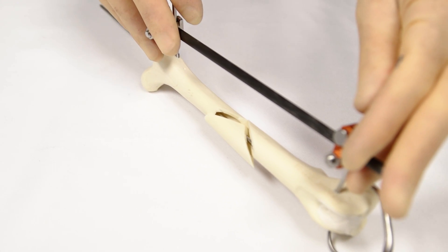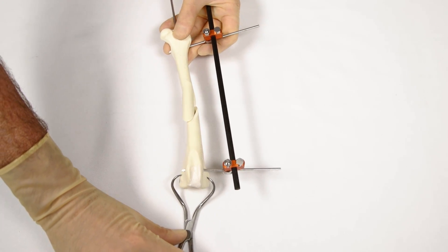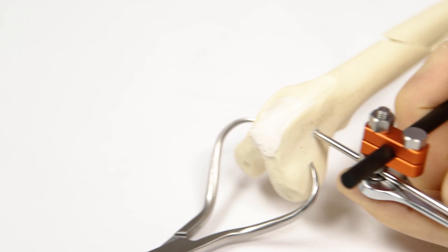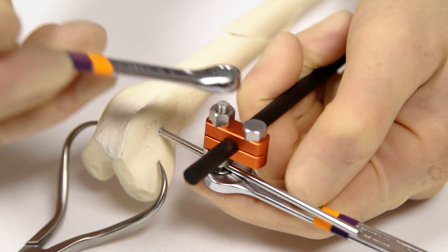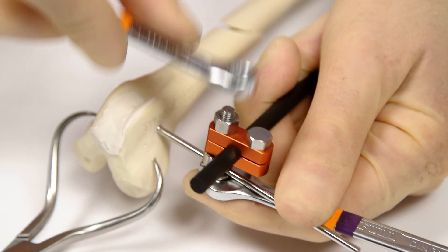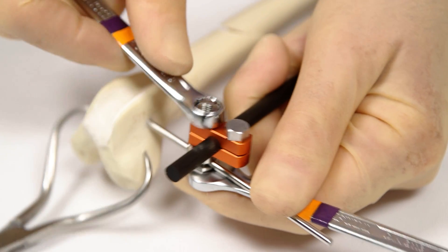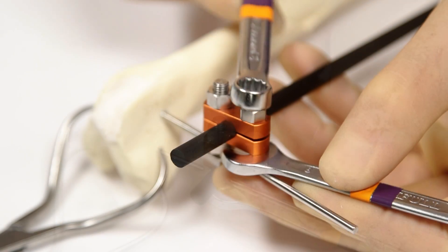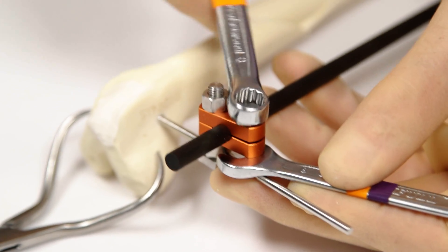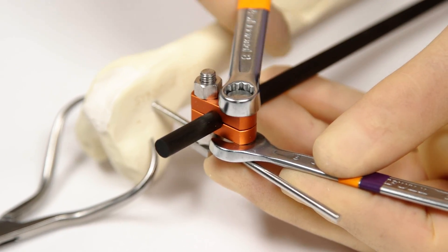Final checks are made as to femoral length and alignment. If the surgeon is happy, the proximal and distal clamps are tightened. The nut of the larger bolt is tightened, which tightens onto the connecting bar and pin simultaneously — one spanner holds the head of the bolt, a second spanner tightens the nut. The smaller bolt is then tightened to further secure the clamp onto the connecting bar. Sequential tightening of each bolt and nut usually works best.